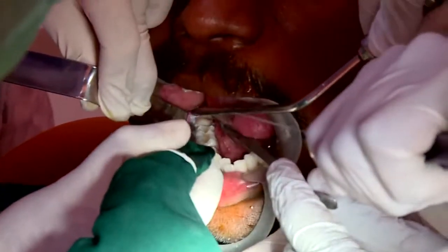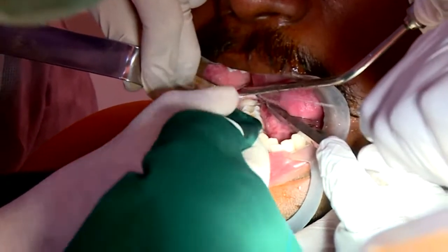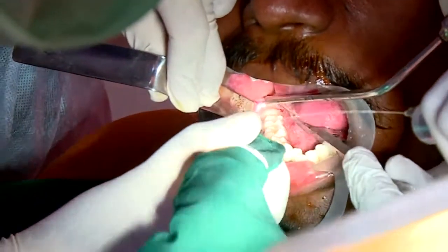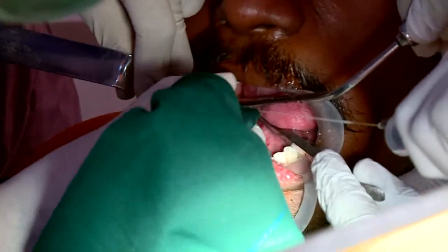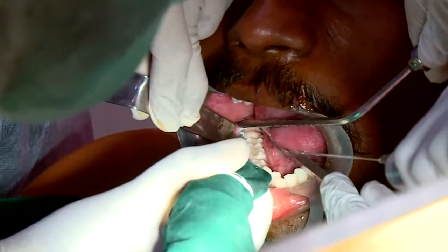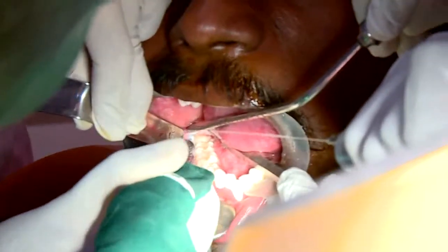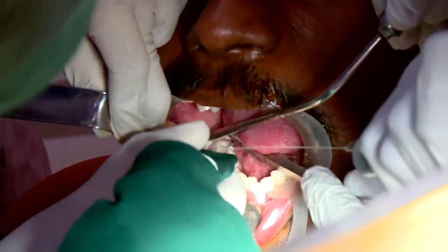Make sure you have good suctioning, so that visibility is always there for us.